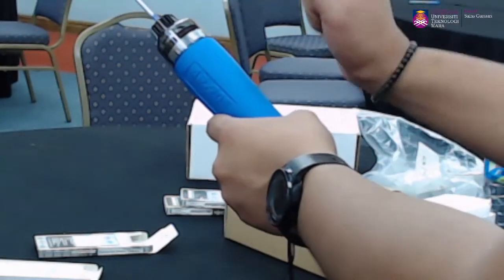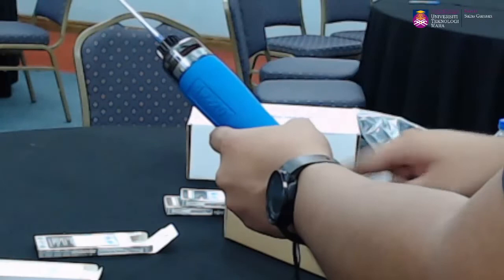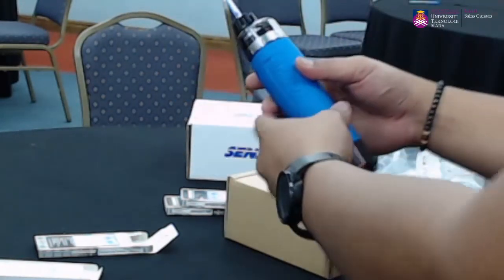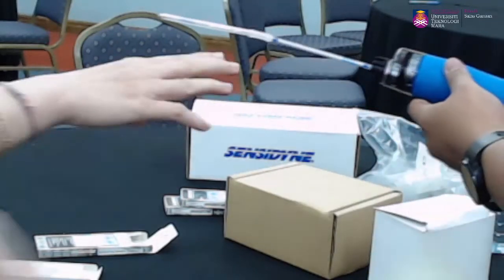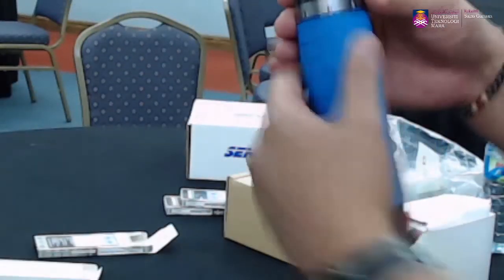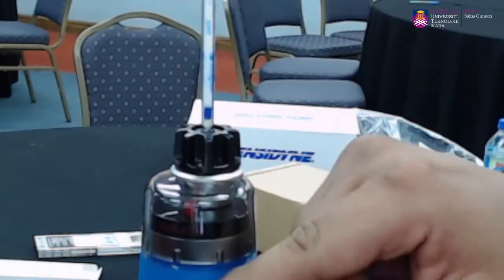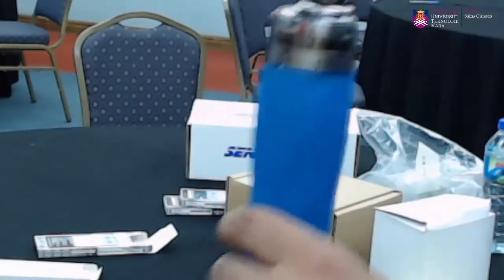Tutup. Kita tolak balik ke dalam sampai habis dan kita align dia balik dan tarik balik. Itu for second stroke lah. Okay, so dia dah keluar. Okay, so sekarang ni, kejap, 1 minit. Dah keluar tu tunjuk kat sini. Okay, so dekat situ dia ada keluar indikator tu lah. Tadi dia ke dalam, so sekarang ni dia dah terkeluar. So means dah habis lah first stroke tu.